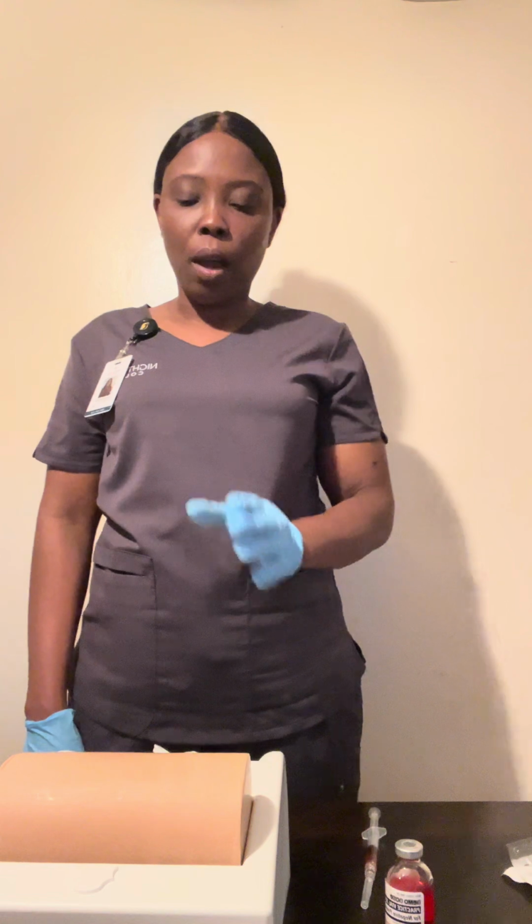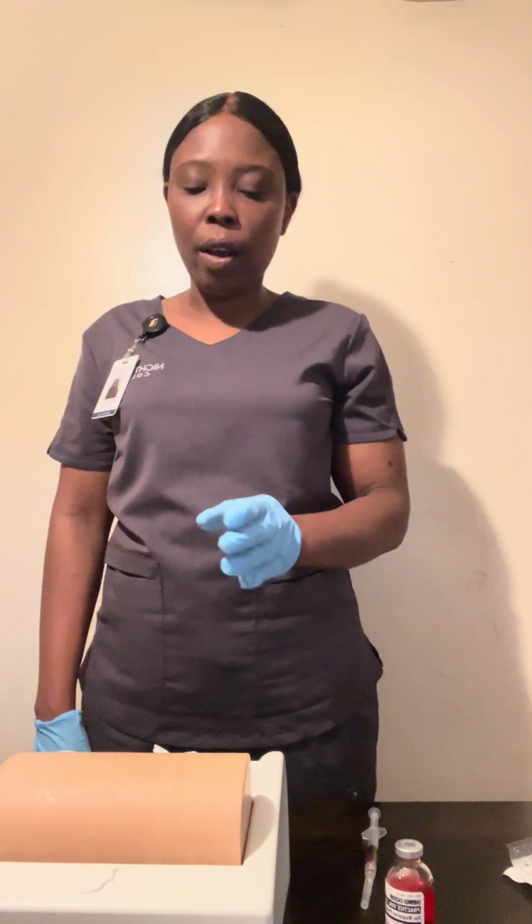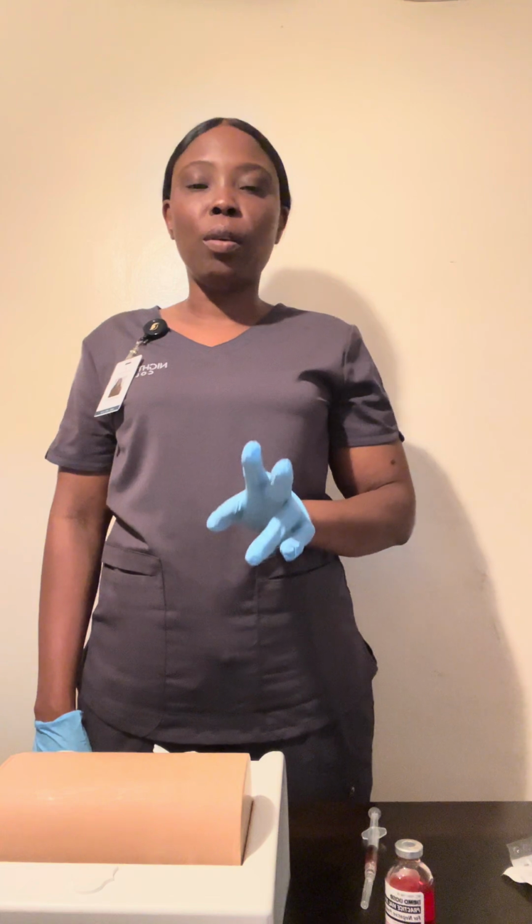I'm gonna make sure the heel of the hand is on the greater trochanter, the wrist almost perpendicular to the femur, the thumb toward the patient's groin, and the fingers pointing up to the iliac crest. I'm also gonna make sure the site is between the index finger and the middle finger, below the iliac crest.